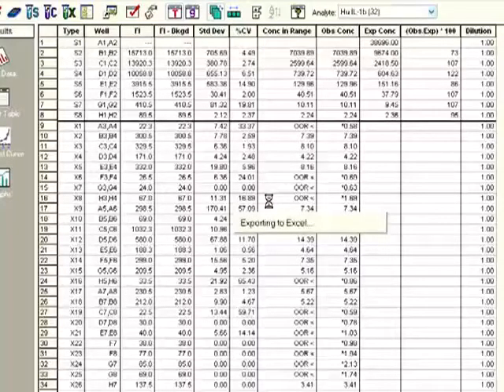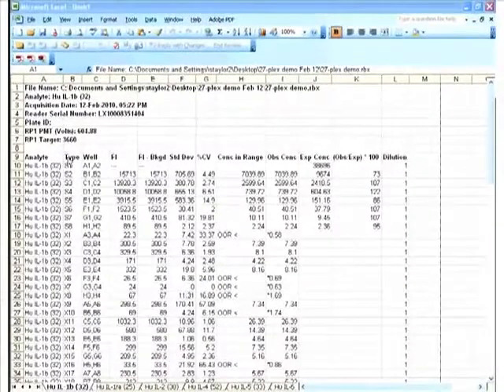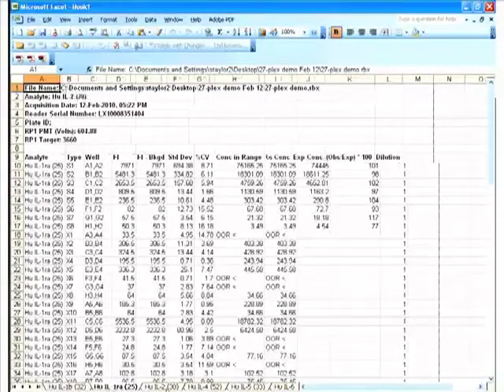So this is a good number of data points. You're talking about almost 3,000 data points here that it's exporting off this plate. This is 27-plex times 96 wells, so 27 analytes analyzed per well that the software is exporting into an Excel spreadsheet, and it's doing it on a single analyte basis, so one analyte at a time. And if I switch over to Excel here, I'll just show you what the data looks like. So there's the Excel spreadsheet, and you can see we have exactly the data that was in the Bio-Plex software that we selected for the quantitative data points, and we have tabs, worksheets going across the Excel.